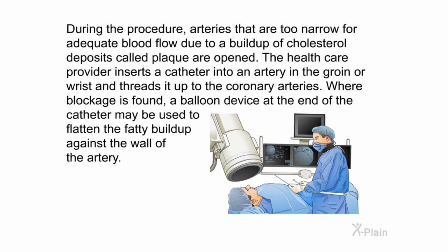During the procedure, arteries that are too narrow for adequate blood flow due to a buildup of cholesterol deposits called plaque are opened. The healthcare provider inserts a catheter into an artery in the groin or wrist and threads it up to the coronary arteries. Where blockage is found, a balloon device at the end of the catheter may be used to flatten the fatty buildup against the wall of the artery.